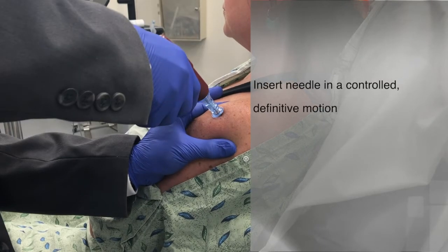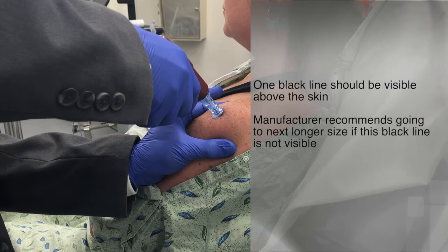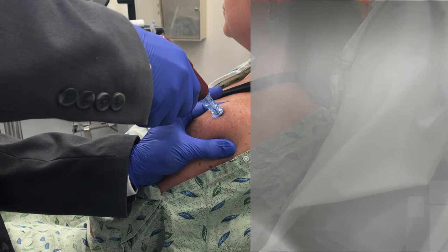This is no more painful than inserting an IV needle. One black line should remain visible. If it's not, the manufacturer recommends using the next larger size. This ensures optimal length for access into the marrow.